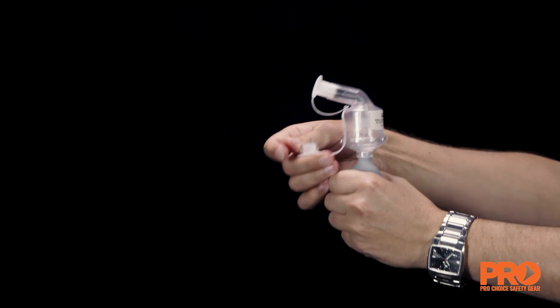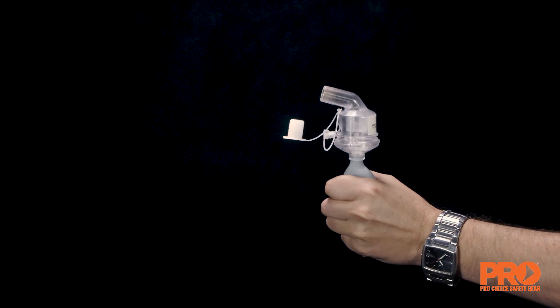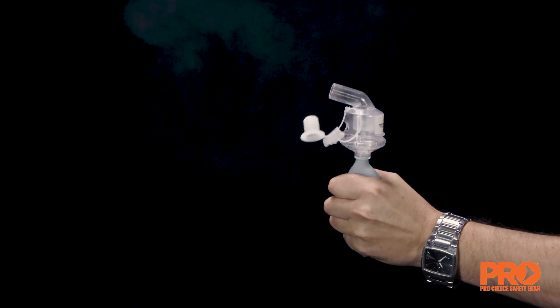Ensure both plugs on the nebulisers are removed during use. Test to ensure the nebuliser is working by squeezing the bulb — a fine mist should be seen.